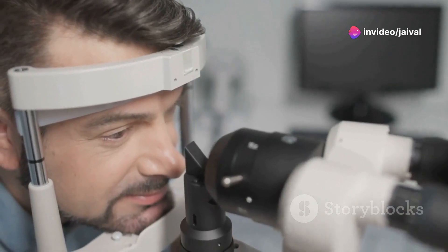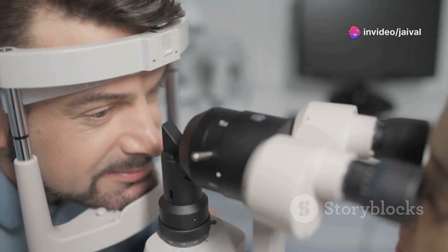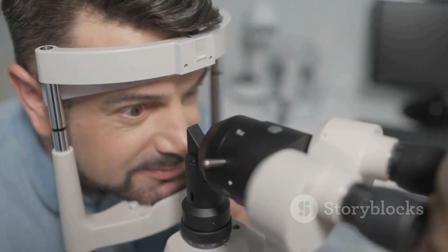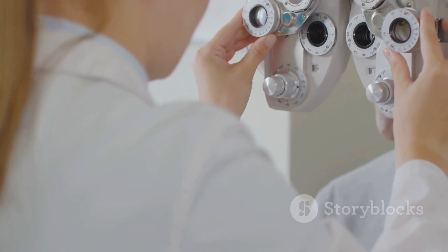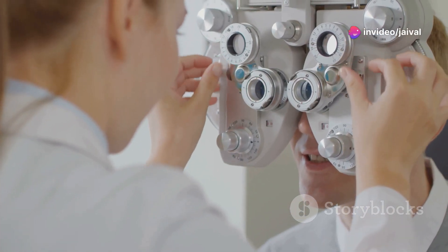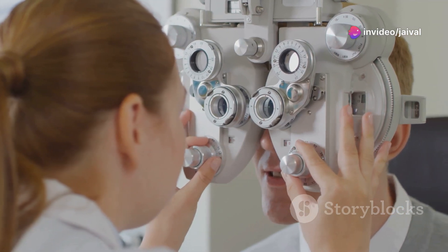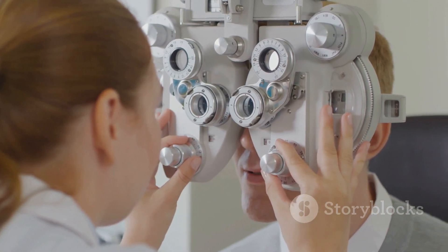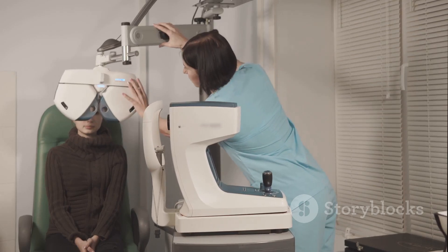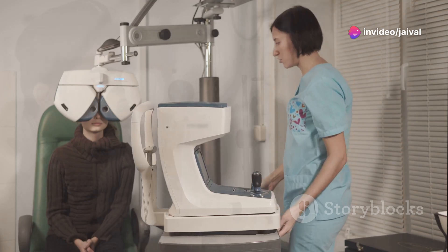Once the lens is in contact with the cornea, rotate it upwards until it rests comfortably. Use the slit lamp joystick to direct the light beam through the lens, adjusting carefully to illuminate the area of interest without causing glare or discomfort to the patient. Accurate placement and manipulation of the goniolens are essential for a successful gonioscopy. Take your time to ensure the lens is positioned correctly and the light beam is focused precisely on the area you need to examine.